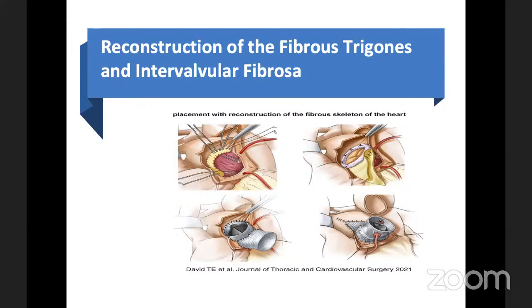And then the sewing ring of the prosthesis is far enough back where the mitral annulus is still preserved. The patch is made like a sandwich between the mitral valve suture and the debrided annulus on the ventricular side. Once the mitral valve is secured in place, the aortic valve prosthesis is fixed in the aortic annulus posteriorly to the pericardial patch. And we can cover any defect in the annulus with the intervalvular fibrosa. And the left coronary can be re-implanted again in the aortic valve.